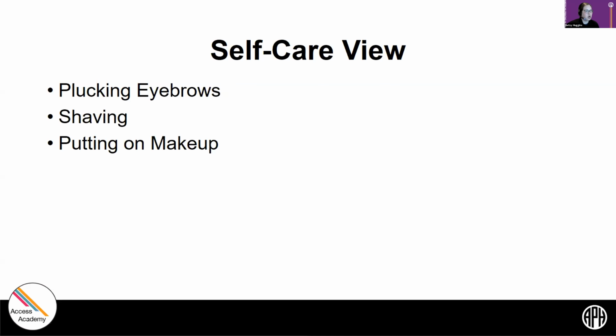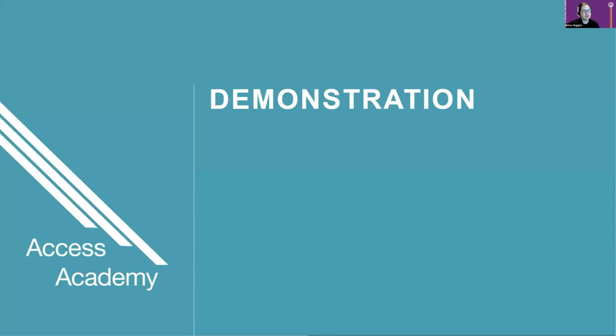Awesome. So we'll talk about the stand in more detail after this demonstration. But in writing view, is there a stand for the device, or does the person need to hold the device in one hand while doing the task? There's kind of use cases for both. So you can have the stand down and use it with the stand, or you can close the stand and hold it above your reading material, and you will need to do that to get a full page OCR capture.